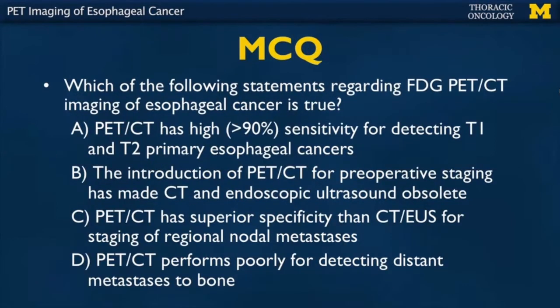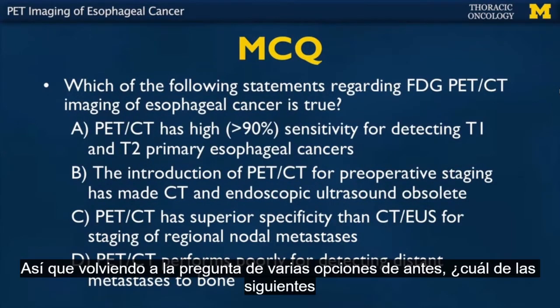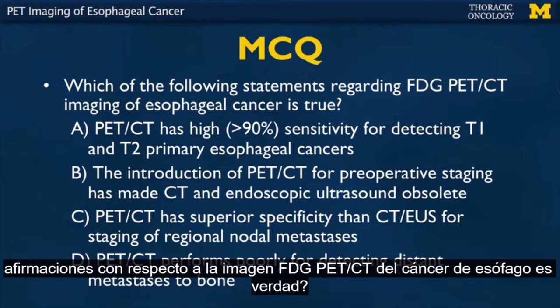So going back to the multi-choice question from earlier, which of the following statements regarding FDG PET-CT imaging of esophageal cancer is true?